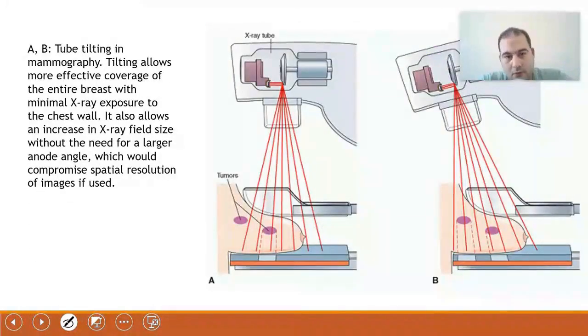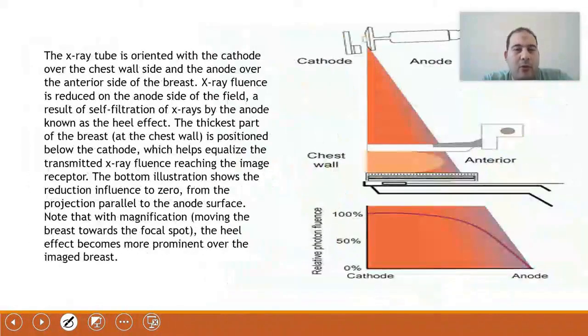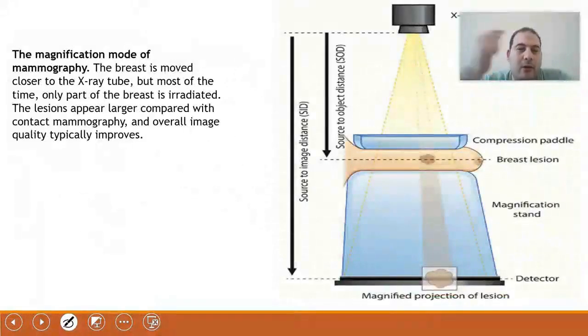Using the characteristic radiation is not effective because it will be absorbed, since the implant is already thick. All these implants will absorb it. So what will reach the detector? I'm working with the spectrum. The goal is for the photon count to become minimal, right? So what is the attenuation of the implant, high or low? High, right?